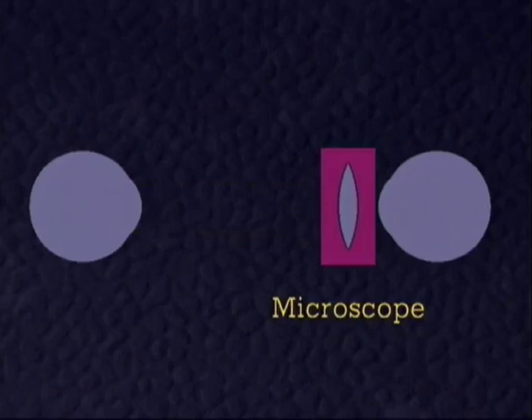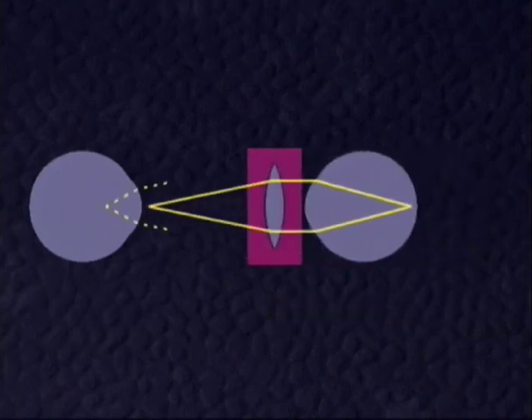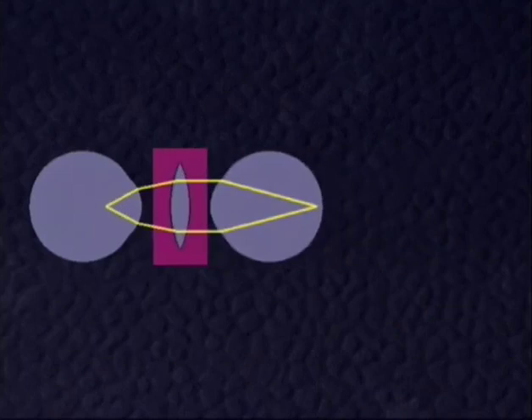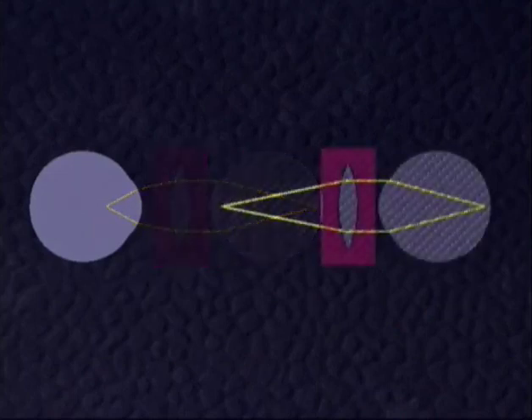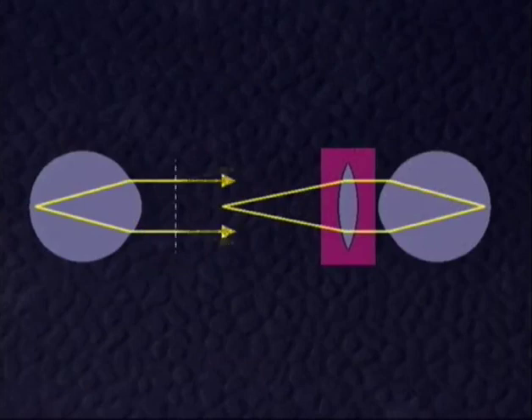However, if the eye of the observer is equipped with auxiliary optics such as a microscope, it accepts only rays from a defined focus, that is, divergent rays. In the eye under observation, only points in the anterior third of the globe emit rays divergent enough to be caught by the microscope. The rays which come from areas more posterior, and which normally emerge parallel, must be made divergent before they can be accepted by the microscope.